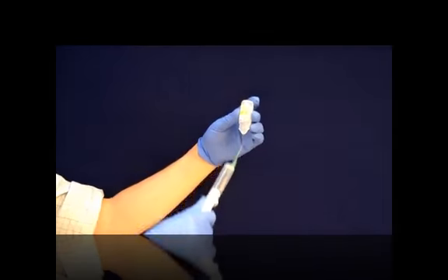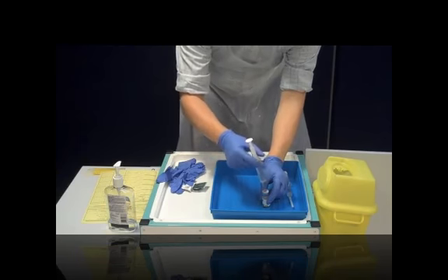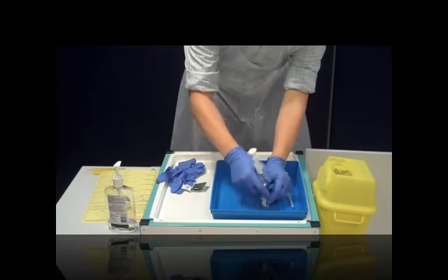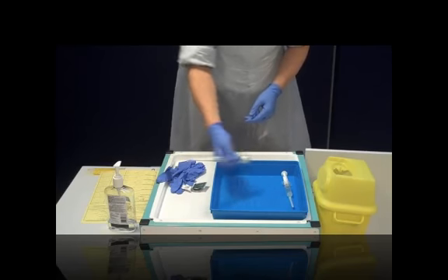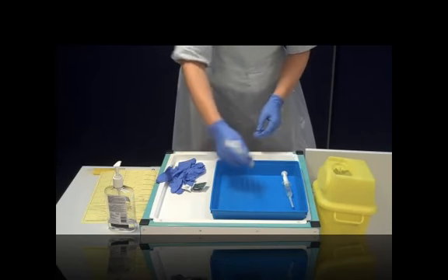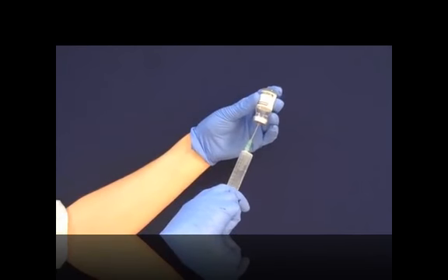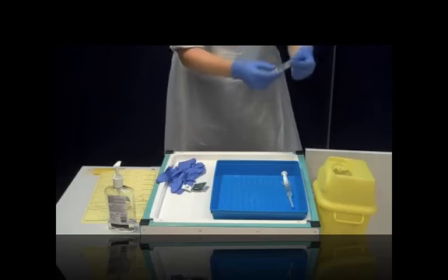Once you've drawn up your diluent, inject about 5 ml into the vial and then release the plunger and allow the air to come out of it. Holding the syringe firmly, give the vial a good shake or agitate it to mix the antibiotic. When that's done, invert the vial, inject the air back into the antibiotic to create a positive pressure in there, and then allow the antibiotic to drain back into the syringe, pulling back on the plunger a little bit to help it. Once you've done that, get rid of the used needle and replace it with a clean one.